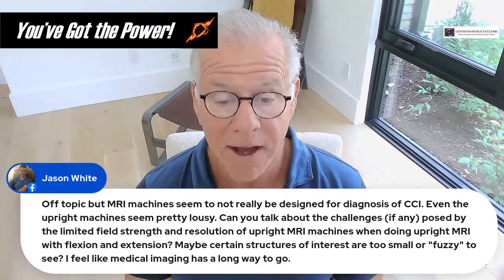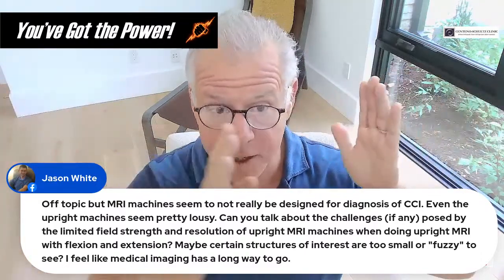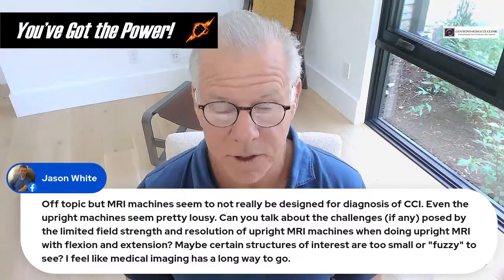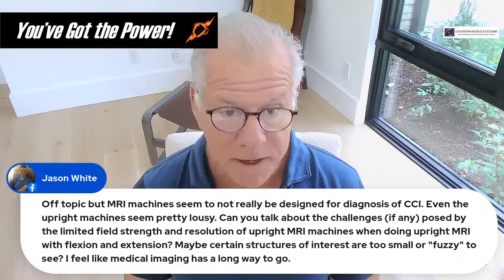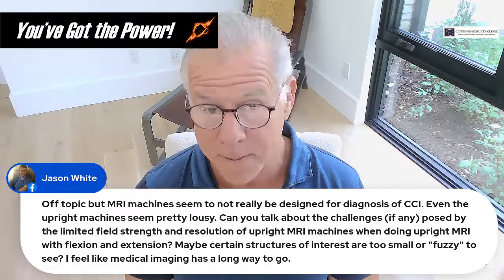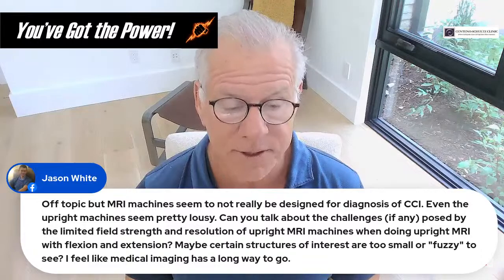Then we have upright machines, where you've got the machine to the left and right, and you can see out into the room. In those cases, you can do things like flexion and extension in most of those units. The problem there is that they're low field strength magnets, and some of them are reasonably good, and some of them are pretty bad when it comes to identifying specific structures.